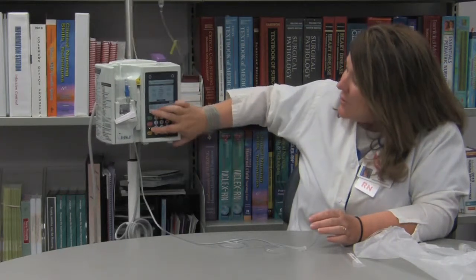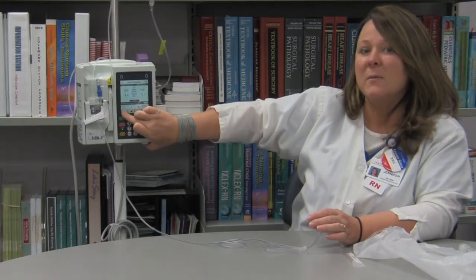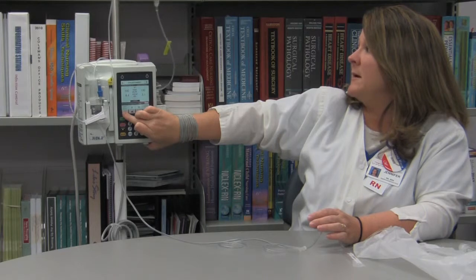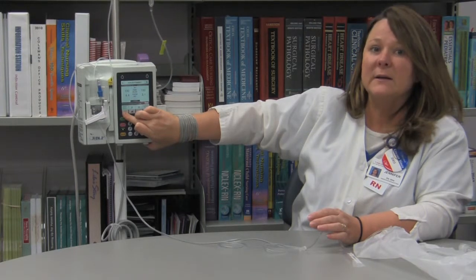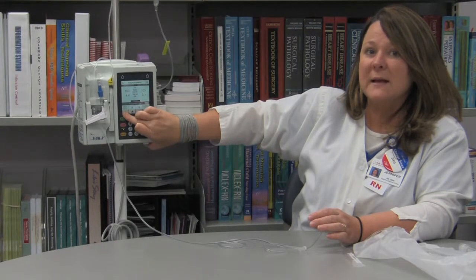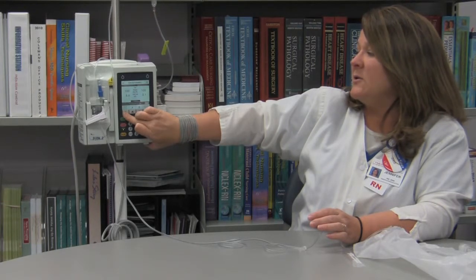So it'll take fluid from your main IV fluid and prime it backwards up into your piggyback. The whole time that you want it to be priming, you will have to hold back prime. So I'm holding back prime. I'm back priming from my primary, as you can see, up into my secondary. So that will help you get the air out of your cassette. And when you feel like all your air is out, you've back primed it all the way up, then you just release the button and hit start.